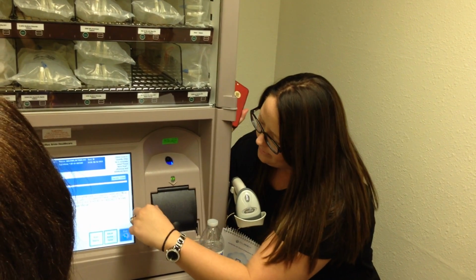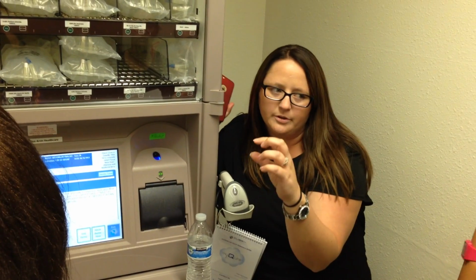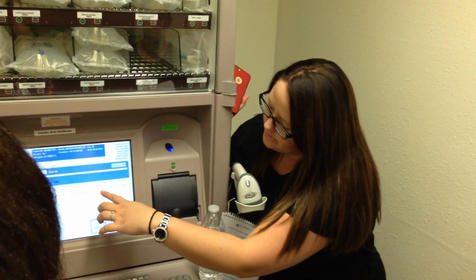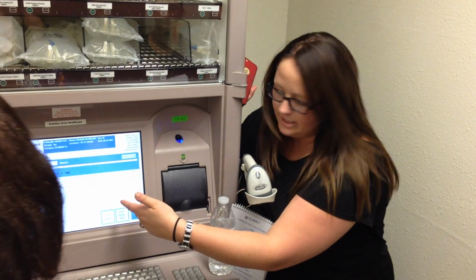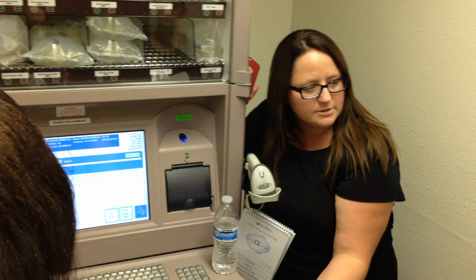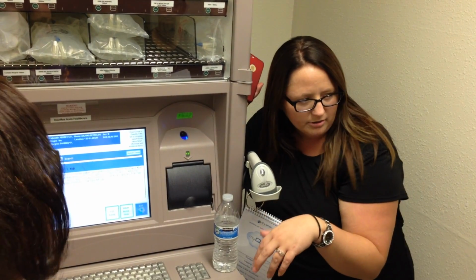You guys can see this, it'll say note on here. If it's a PRN, it'll tell you up towards the top that it's a PRN, in capital letters, so it's pretty easy to see. And then it tells you the SIG, so it'll tell you that they need 1 to 2 or whatever it is. So if you're questioning why it says 0, just tap in the quantity box and change it to what you need, okay?